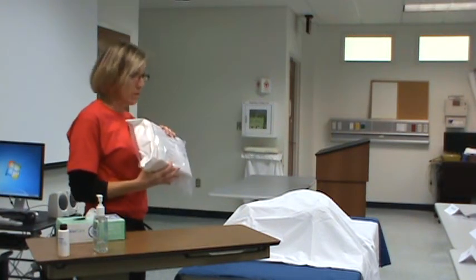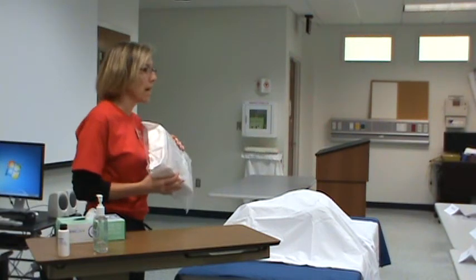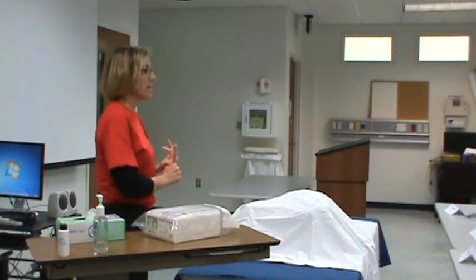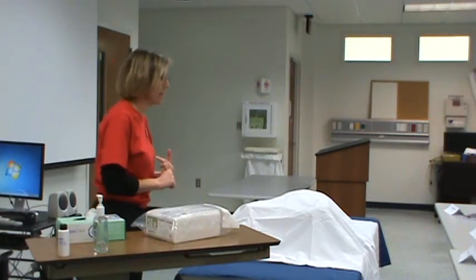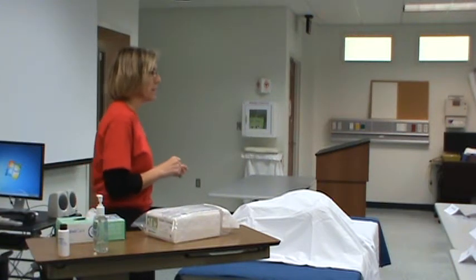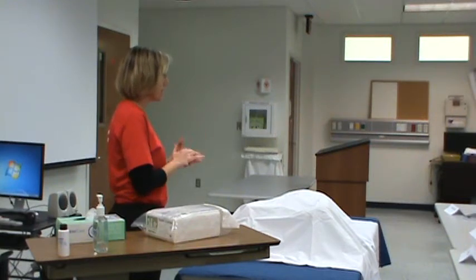And we have, with the students, placed a non-latex Foley on patients. And so it can happen. It happens a lot, in fact. And so you ask the patient if she has any latex allergies or if she's allergic to betadine. I haven't had too many allergic to betadine, but if you do, you switch it out with probably a Hibiclens or whatever the hospital has that has no iodine in it. So you ask them those questions.